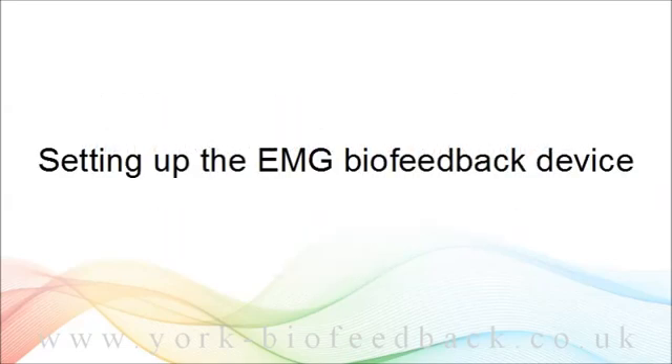This video shows you how to set up the EMG biofeedback device. If you've rented one, may I just take the opportunity to remind you to please keep all the packaging material, including the small plastic banks that contain cables and small parts.